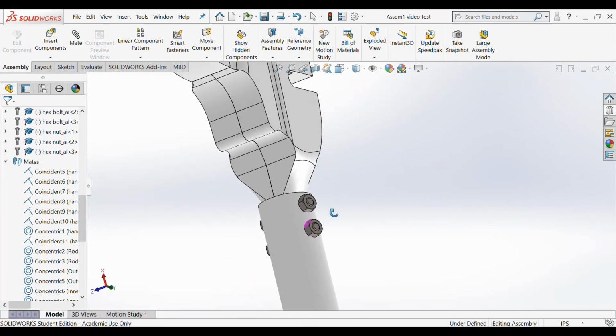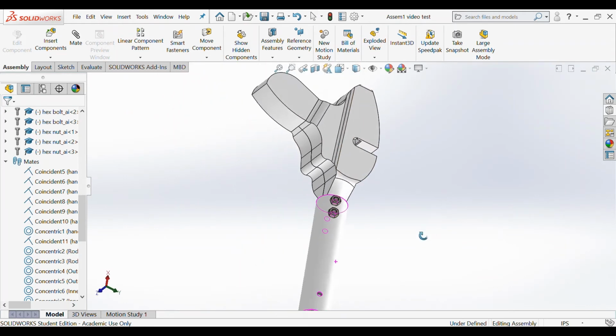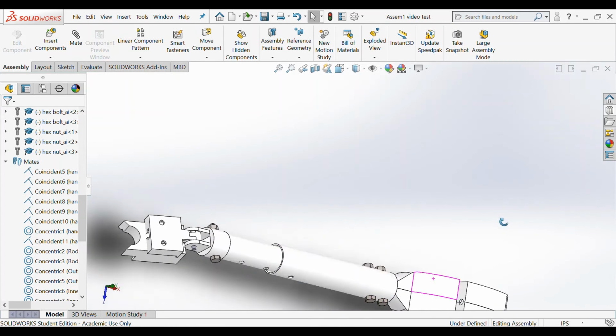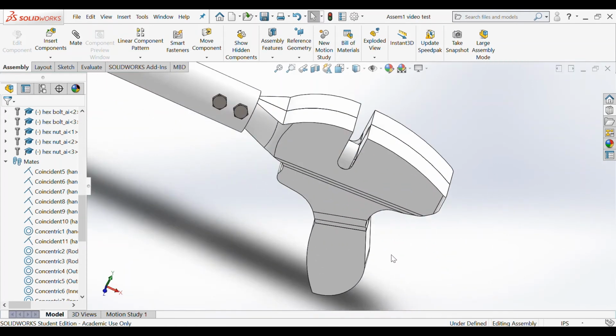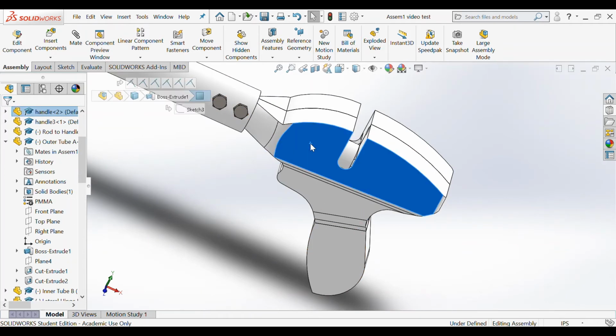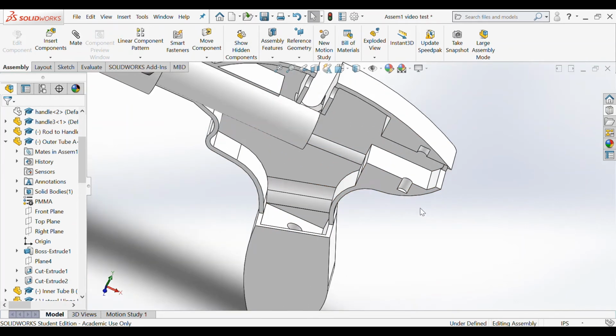Next, I'm going to insert the inner components to the handle. So I'm going to go ahead and zoom out and rotate the piece to make it easier. One thing that's going to help us is I'm going to click and then right click on this piece of the handle, and click hide components. So it just makes it visible on the inside.